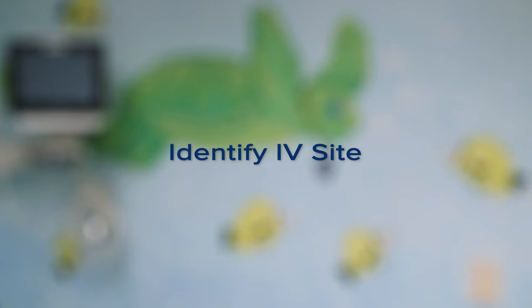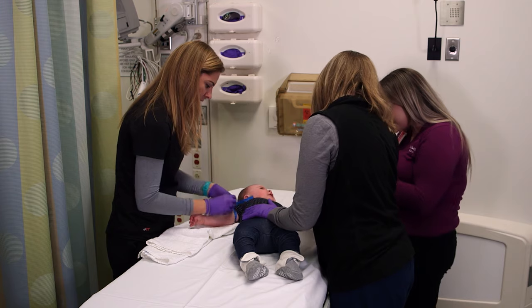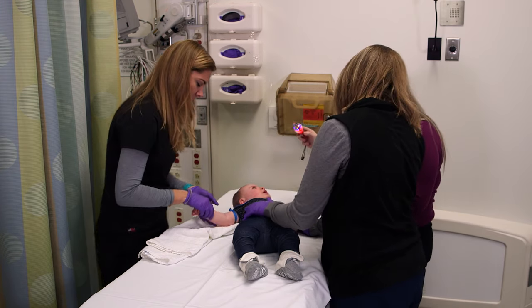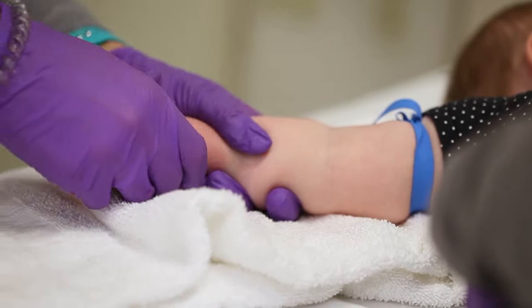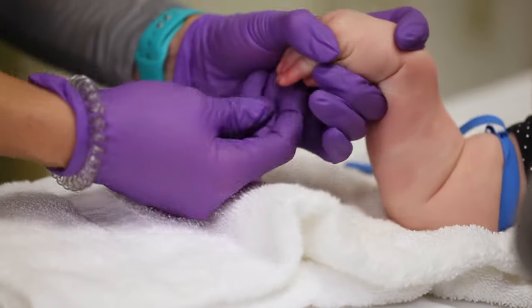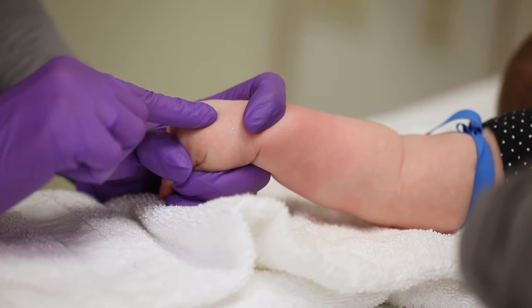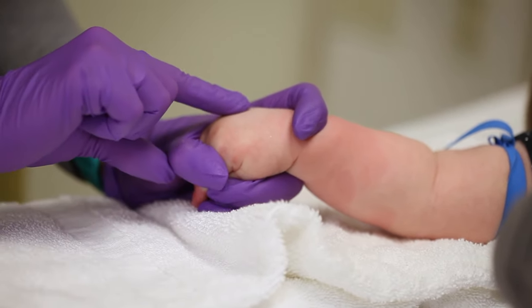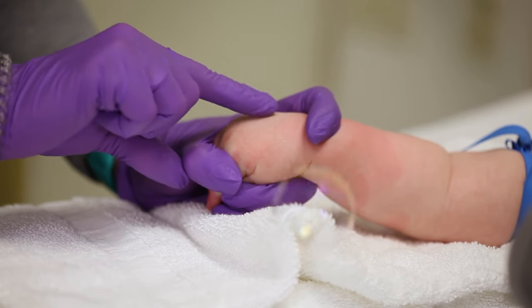The first step is to identify where you'll place the IV. Begin by applying the tourniquet to better expose veins. Look first in the antecubital fossa or in the hand — there's typically a vein close to the surface. If you can't physically see it, try feeling for it. Hand veins work particularly well for young patients who tend to bend their arms more frequently.